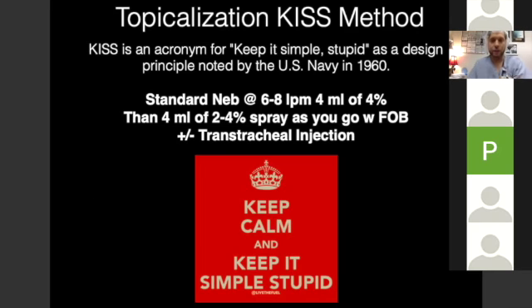Now, the transtracheal injection I've done several times. It's a good option. You saw it on the video. So one pointer is when you feel your cricothyroid membrane, don't take your hands off and then put the needle through. Keep your hands there and go between your two fingers. You very easily could lose sight of the midline. So keep your fingers there.